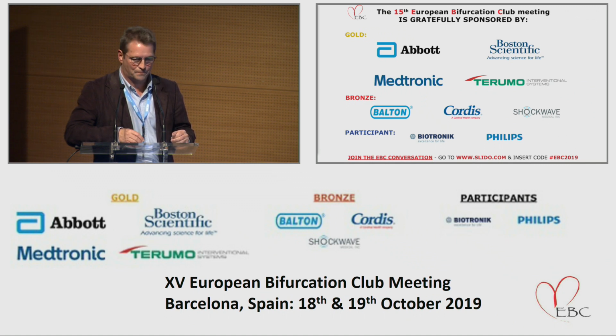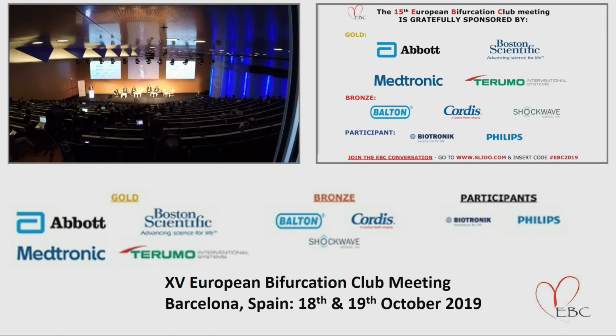Yeah, last question? Just two small comments. I think in this large mismatch situation, it's better to have an idea about the ratio between LAD and left main diameter, so you can go with the appropriate balloon right away. And the other issue, my concern is about shortening when you are inflating this kind of stent with a very large balloon.